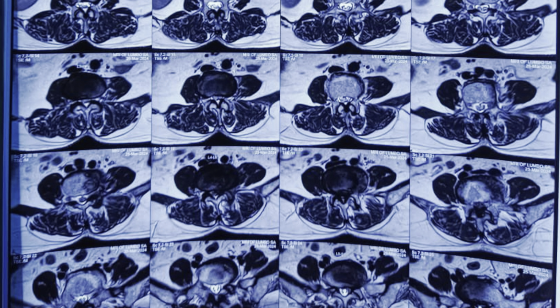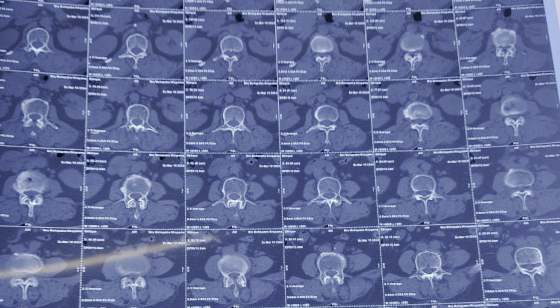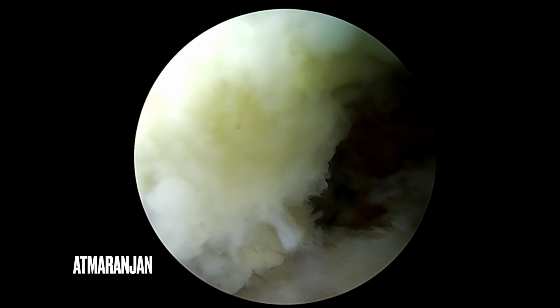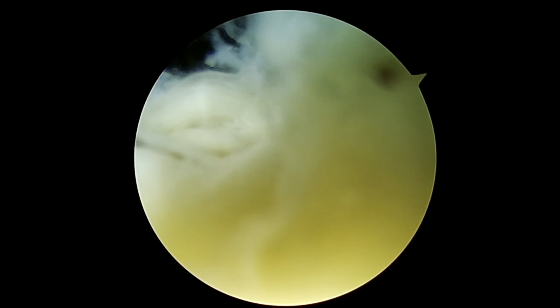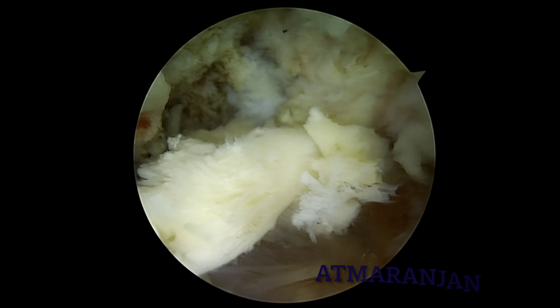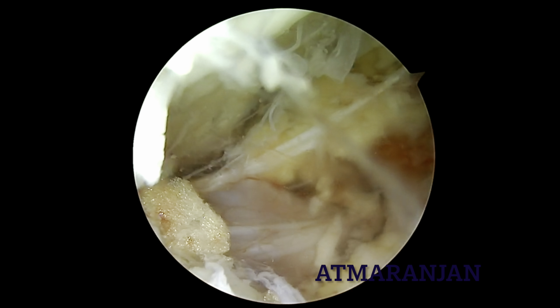In the pre-op CT scan and the axial scans of the MRI, you can see the L3-4 is completely stenosed. Here in the CT scan also you can see the orientation of the spine. Now we started the procedure by moving to the fusion first, which is at L4-5 level, with decompression at L5-S1 and L3-4 level.